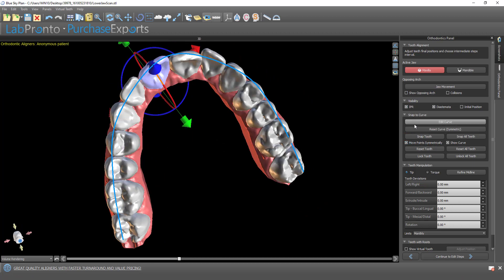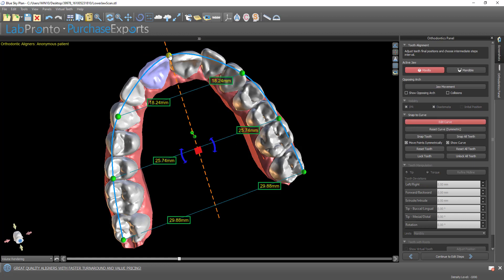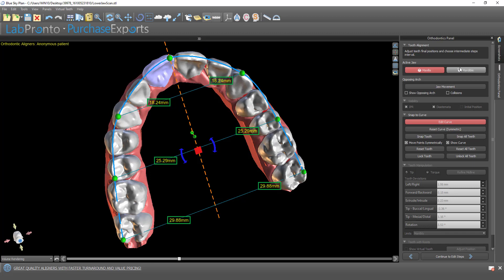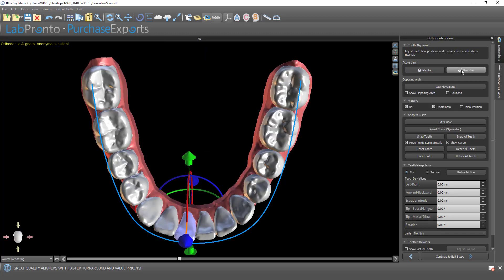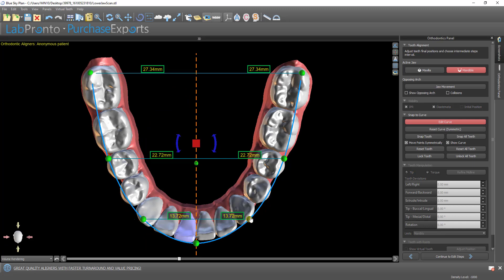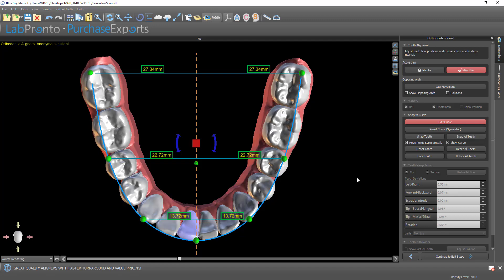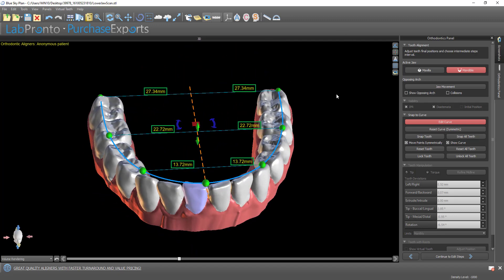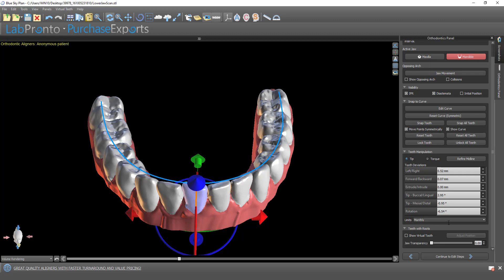Edit the curve slightly, snap all teeth, switch jaws, snap all teeth. Let's say that we now have our tooth set up. We're going to continue to edit steps.